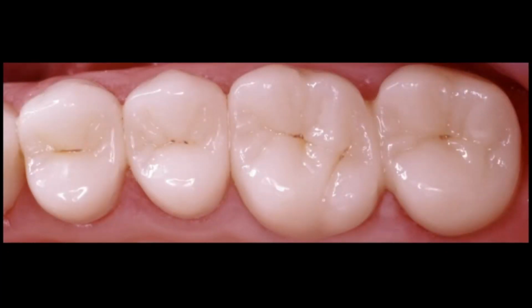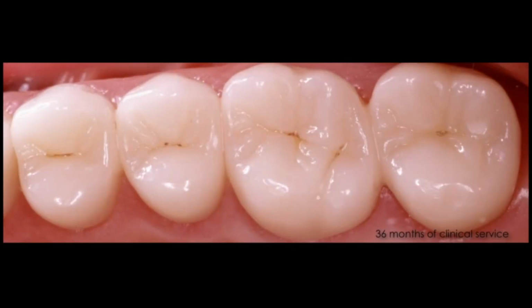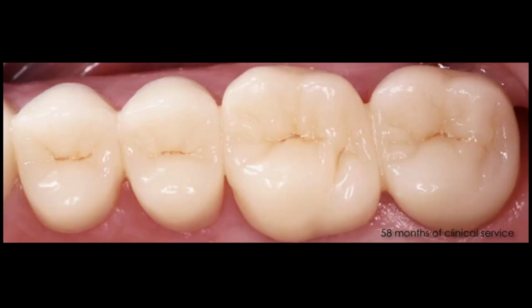The question is now, how long can they stand it, this new situation? And you see we have pictures now. I just did a recall on him in 2014, this June, in the beginning of this month. And it was actually last week where we took these pictures, and you see it looks great, it works. And the principle was nothing else than using staining technology, monolithic approach for the posteriors, and layering for the anteriors. This was after placement, this was after 36 months of clinical service, and this is 58 months of clinical service. And you see they are still working nicely.